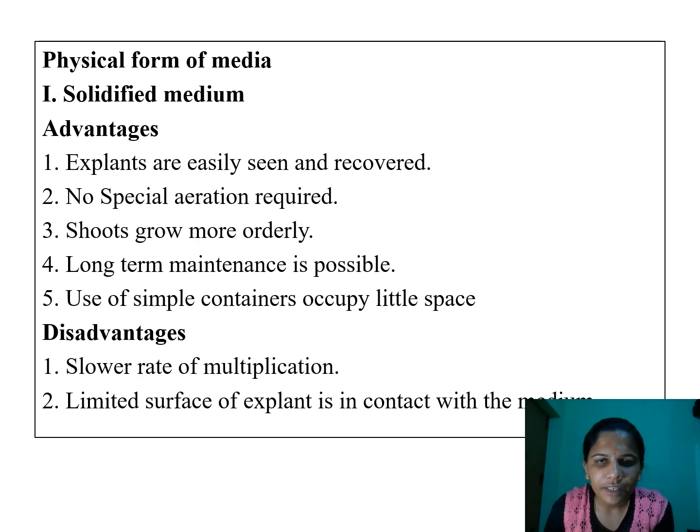And we can keep it for a long time. Also, we can use some small containers. Even in small containers we can use this particular solid medium and easily handle it. The problem here is that with solid media the rate of multiplication will be less. Suppose from one explant we can get around 4 to 5 multiplications. But that is one disadvantage.